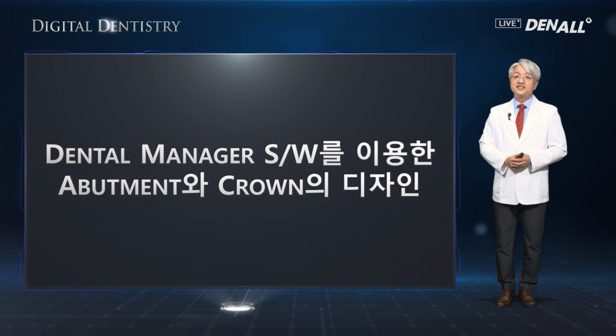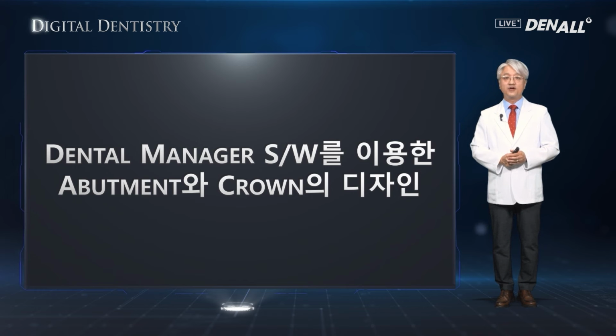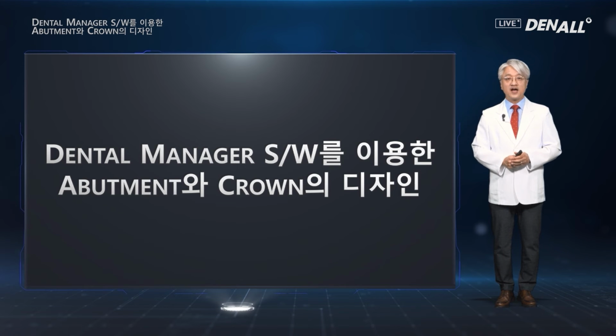I talked about designing abutments and crowns using Dental Manager software. Practice makes perfect. Based on what you learned today, with your practice, I hope you can enjoy more complete designing activities. Let's go to the Q&A session.